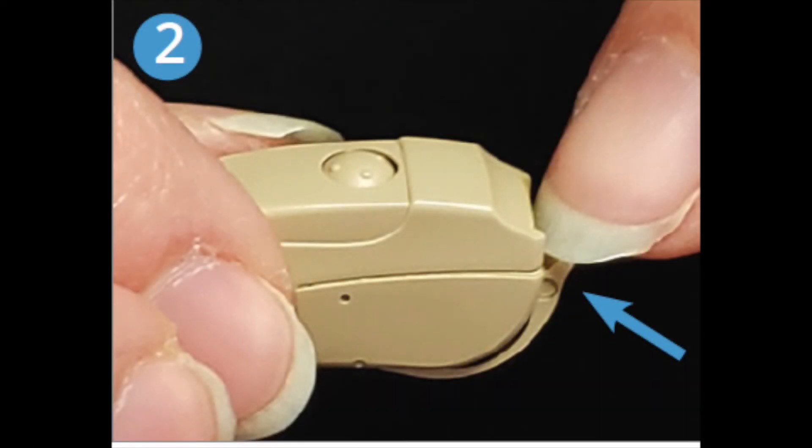Step 2: The Sona has a two-stage battery door. Press down on the battery door tab until the door opens slightly, as shown in the image.